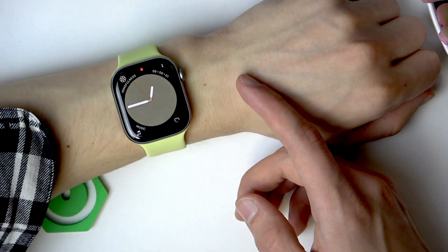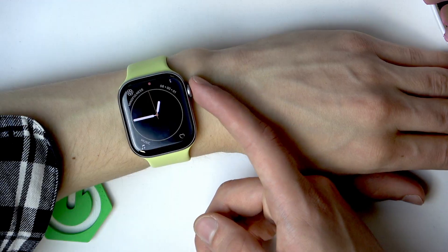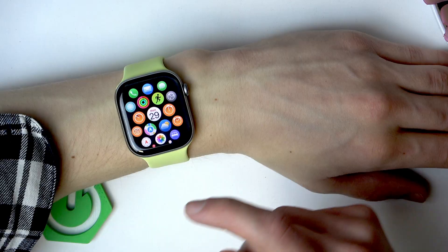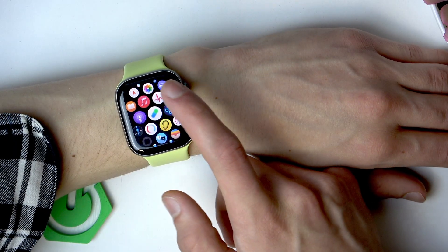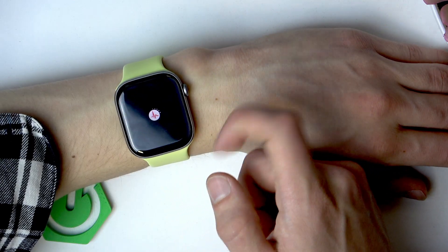Then you have to rest your hands. For best results, try to rest your hands on a table or any other surface. Then open the list of all apps by pressing the digital crown, find the ECG app, and tap on it to open.